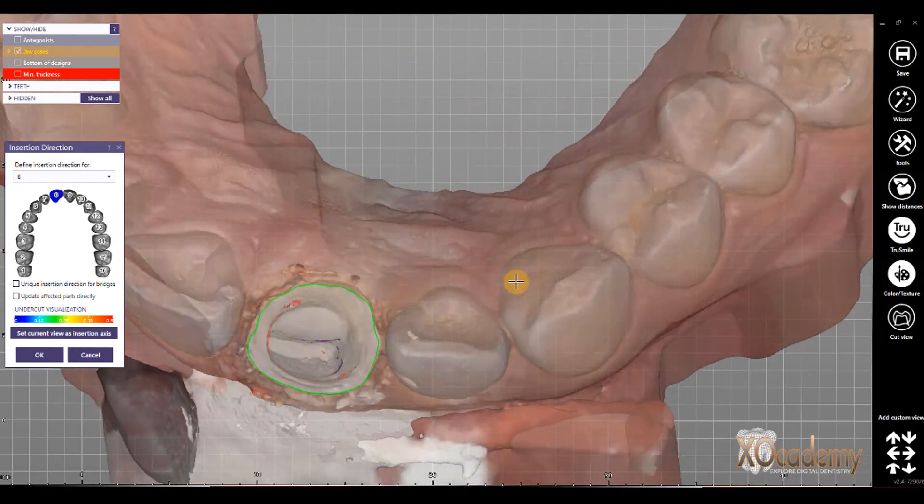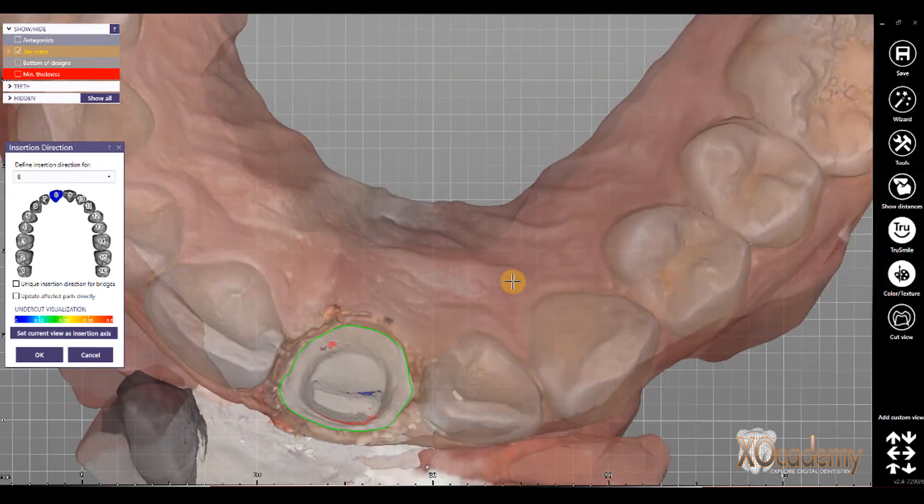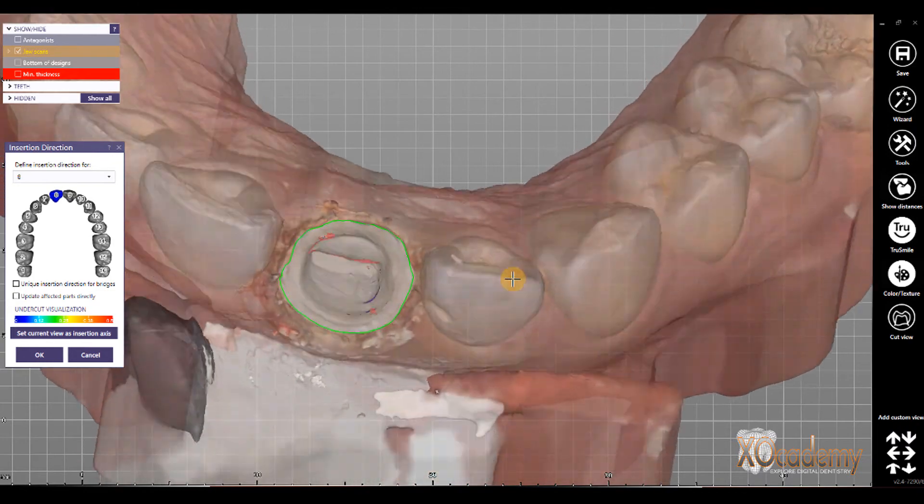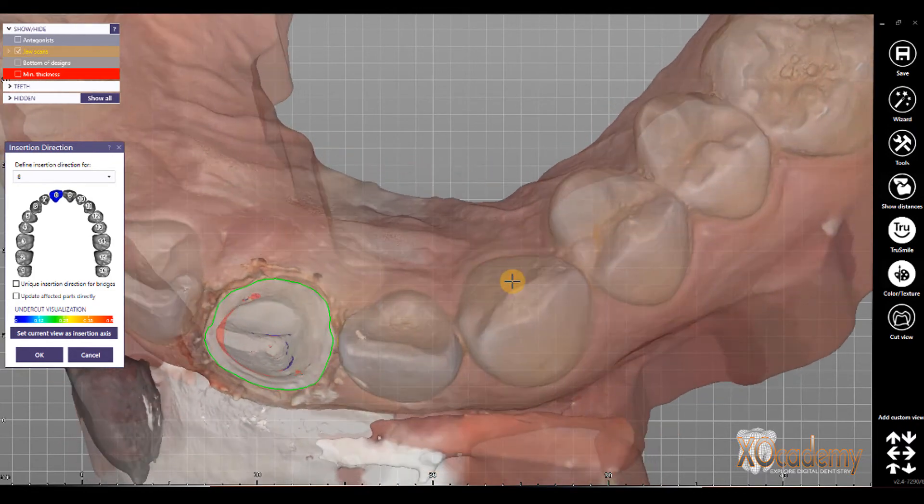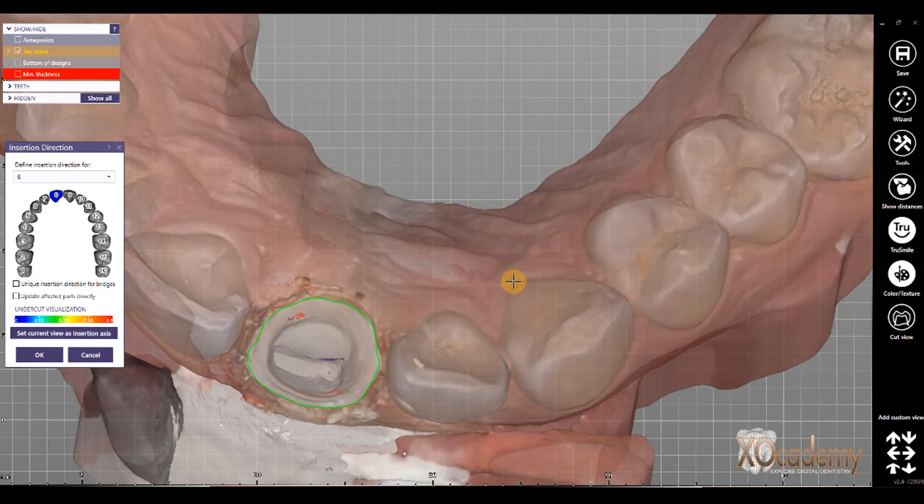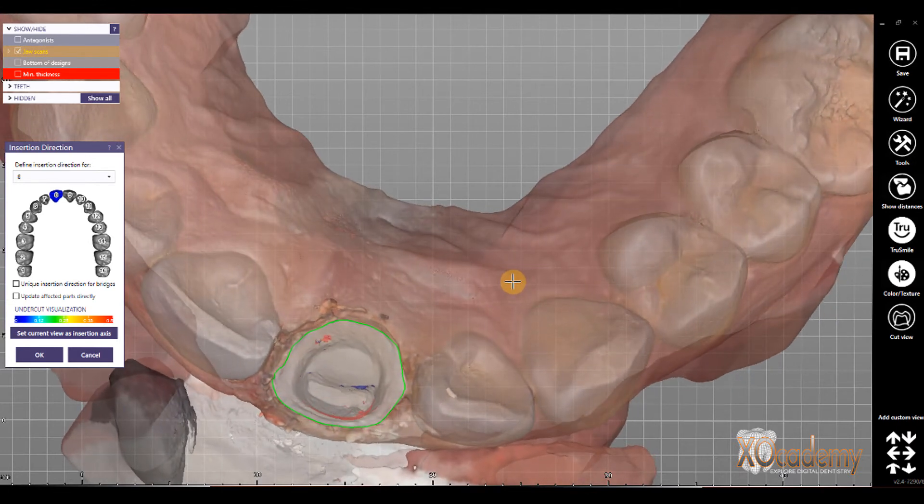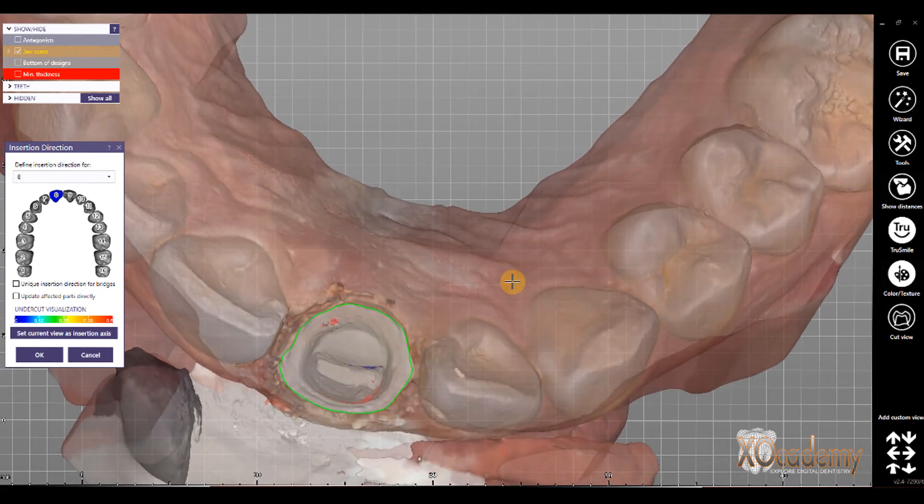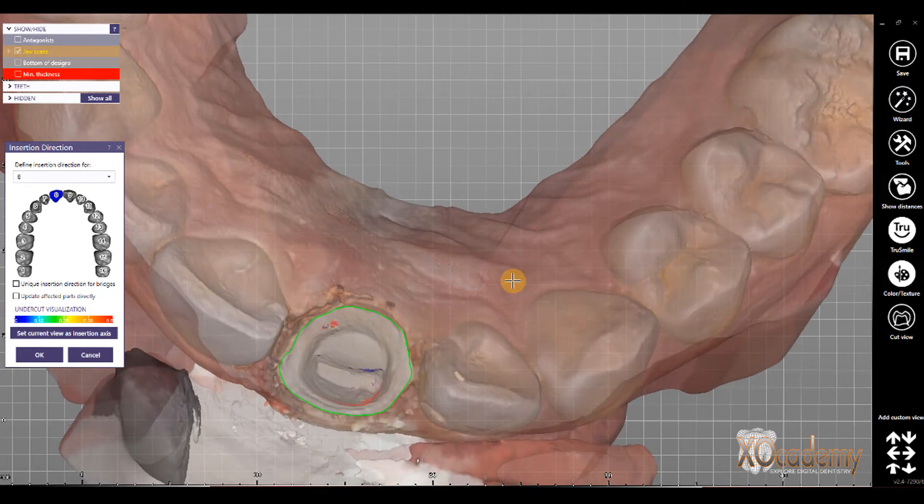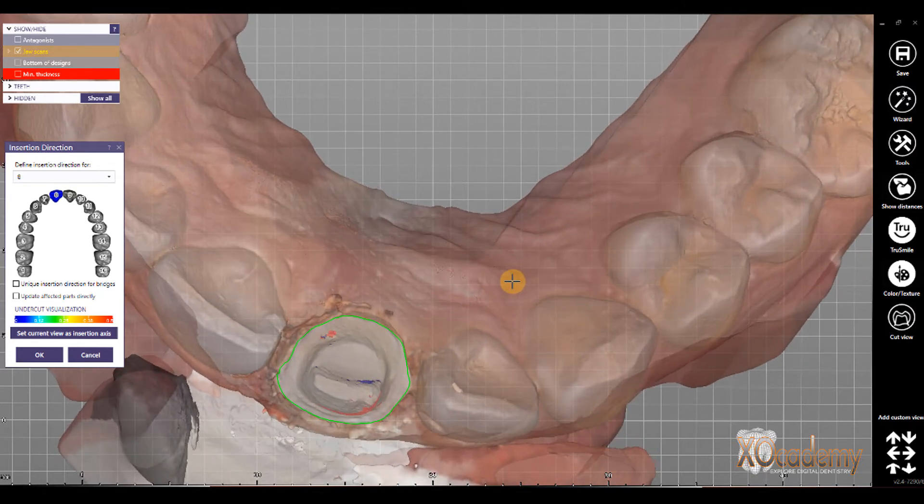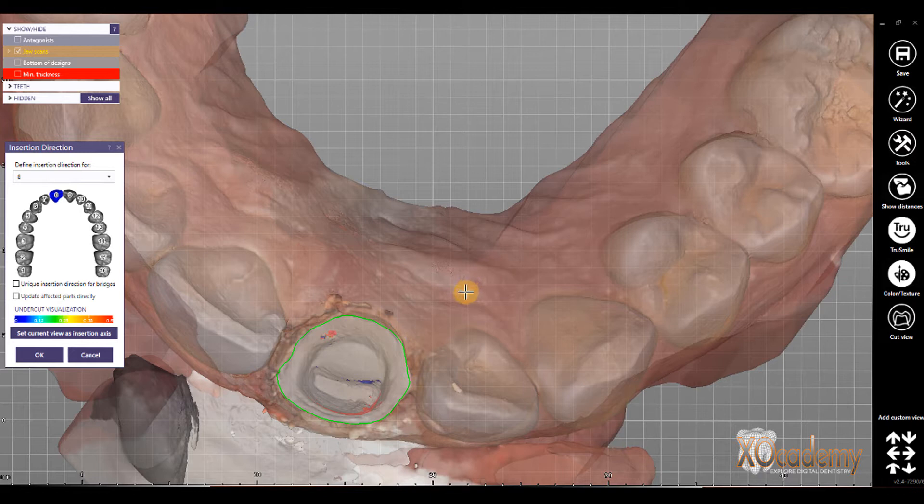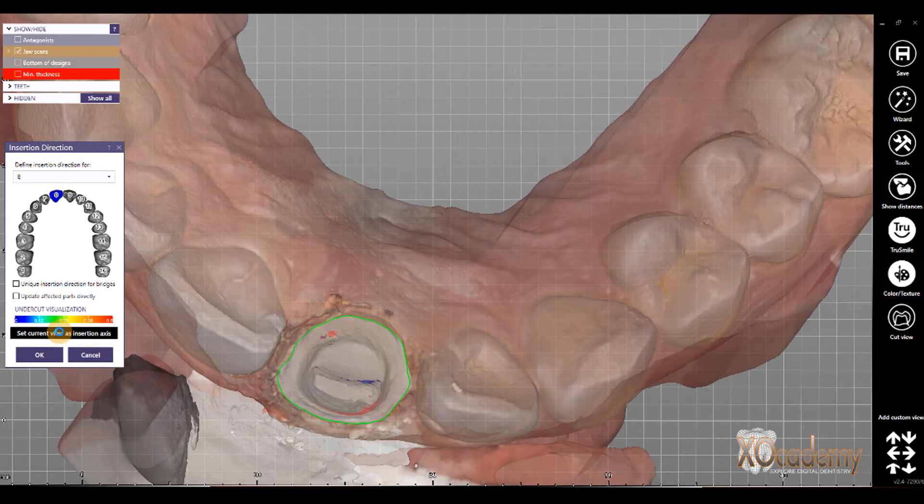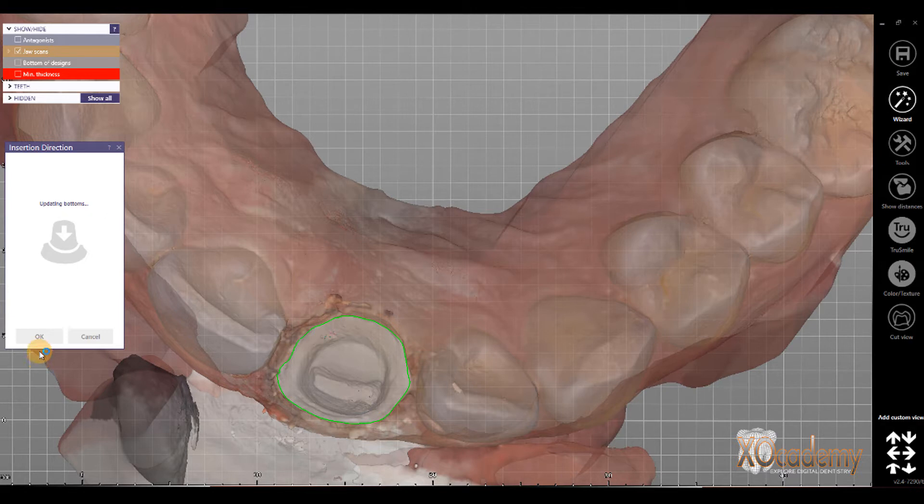This shows us our undercuts, undercut visualization, and so I always like to make sure, and in this case, I want to make sure that we are as close to parallel with number 9, so we reduce any embrasure space. In this case, I actually want a little bit of an undercut, because I want my contact area on number 9 to be very long and broad, so I'm going to set this view as the insertion axis, and then click OK.